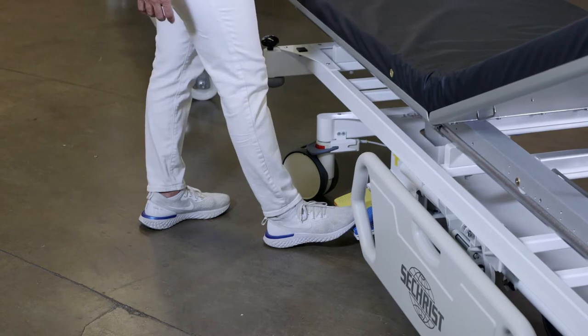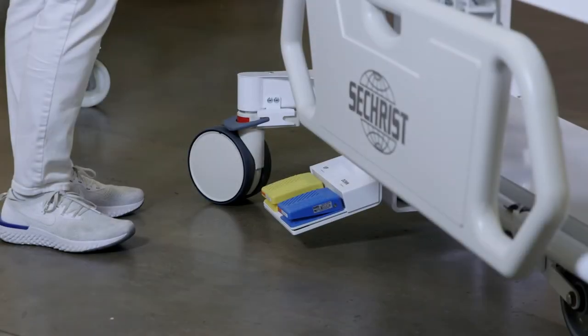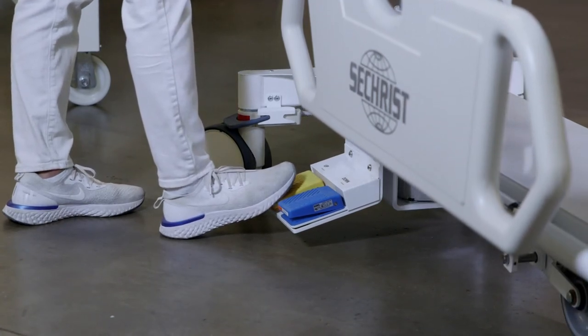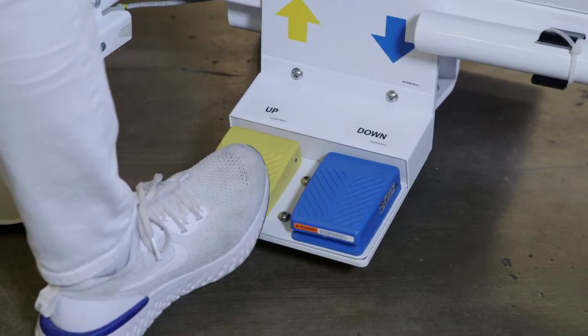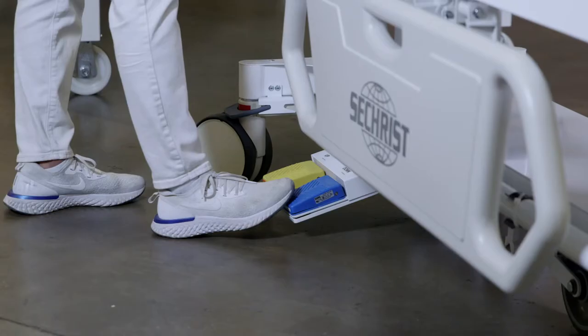Why is this an advantage? For your patients who have a difficult time getting on and off gurneys — who are maybe not ambulatory or in a wheelchair — this goes down so low that they can easily sit on the gurney to get on top of the stretcher. This is the only wheeled gurney in the hyperbaric industry that has this unique feature. With the simple touch of a button, you can easily raise your eGurney and patients up or down using the yellow button for up and the blue button for down.